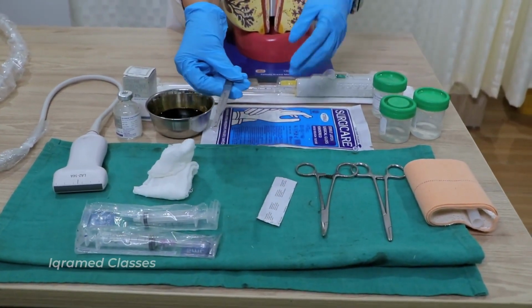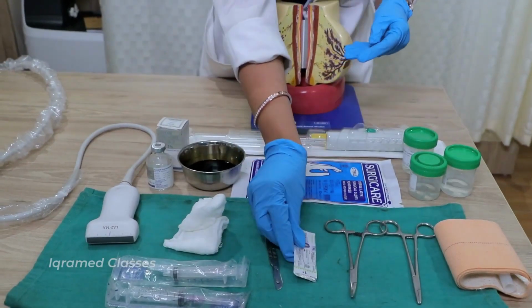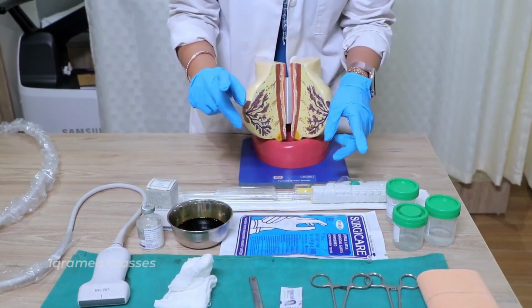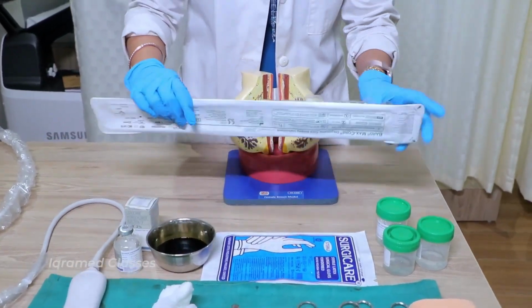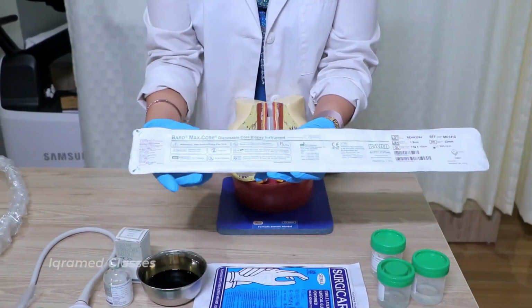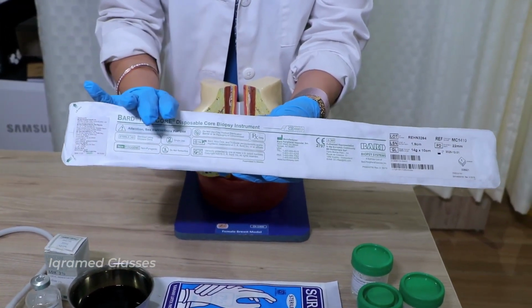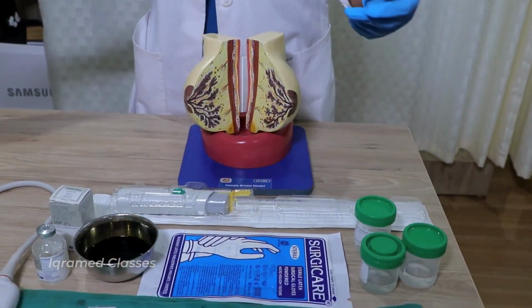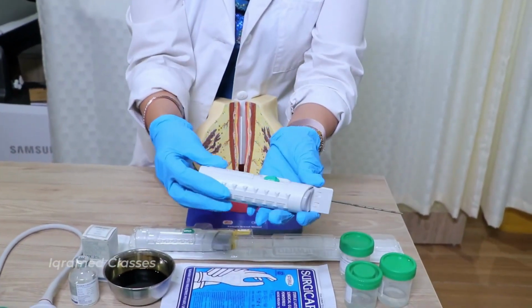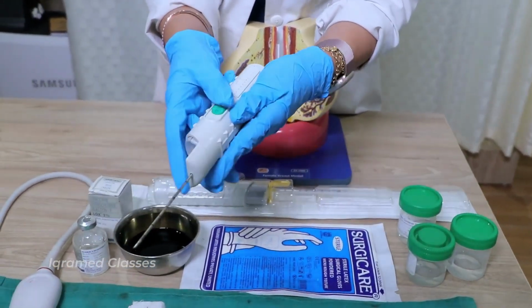This is the blade holder, and we use a number 11 surgical blade. Give a very small nick, we will show you how to give that. With that, through that nick, we are going to use the BARD Max-Core disposable core biopsy gun. This is what we use. Now we have to show you how to use this gun. This is very simple to use. It is automatic. It has got a depth of 22 mm.